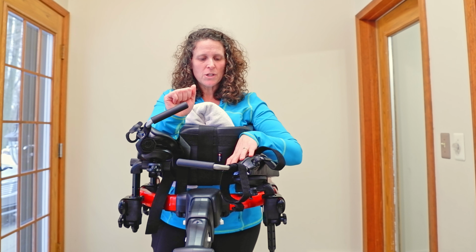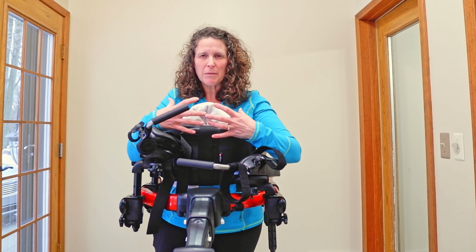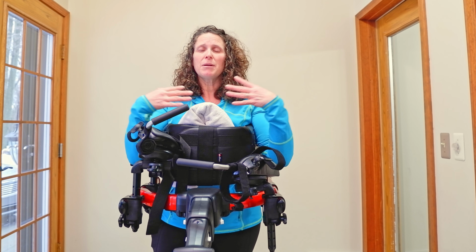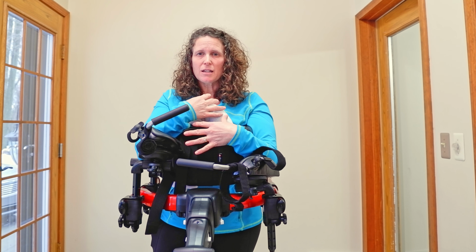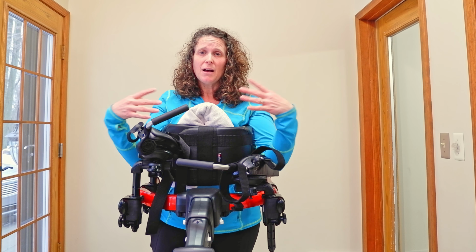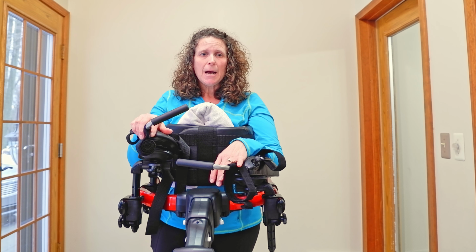This is also just a really great technique just to keep them in tight, and that gives them a little bit more proximal support so that maybe they could lift their head up. Maybe that proximal support, having their arms in snug, a little bit of support at their chin, maybe that would free them up for some ability to move their legs if they have the proximal support that they need.